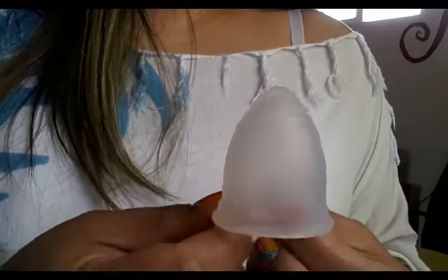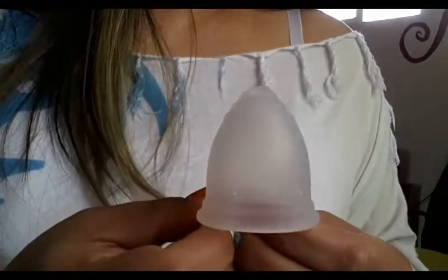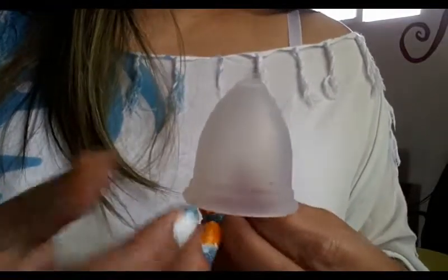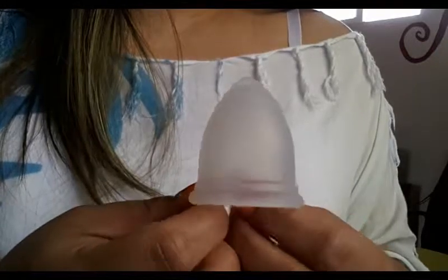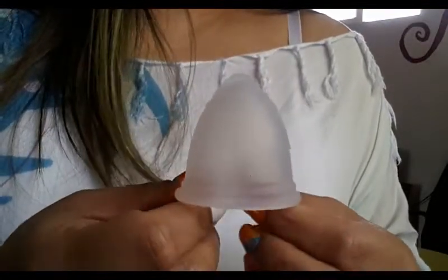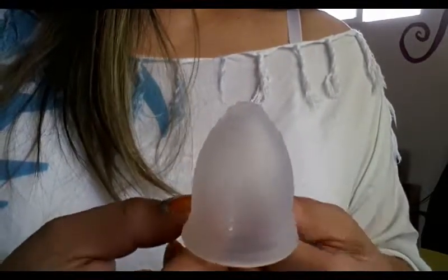The Ruby Cup only comes in one size, and they have three different colors. This is the clear and they also have a pink and a blue. I did purchase mine in a de-stash so sadly my purchase will not help anybody, at least not yet. Hopefully I can help you answer some questions you might have had about the Ruby Cup. Mine was in a de-stash so I didn't get the box or bag or whatever it originally comes in, and I also didn't get the pamphlet that has instructions and information on use, storage, and cleaning — but you can find all of that information on their website.